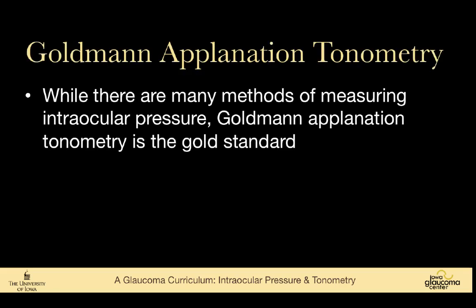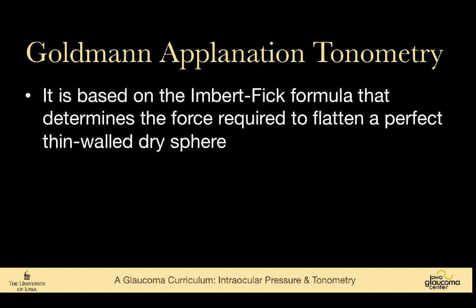Applanation tonometry is the gold standard. This is what I believe most glaucoma specialists use in their clinics to take care of most patients. It does not work on all patients, but it is a very fine way of measuring intraocular pressure. It's based on a formula called the Imbert-Fick formula that determines the force required to flatten a perfect thin-walled sphere. Of course, the eye is neither perfect nor thin-walled.